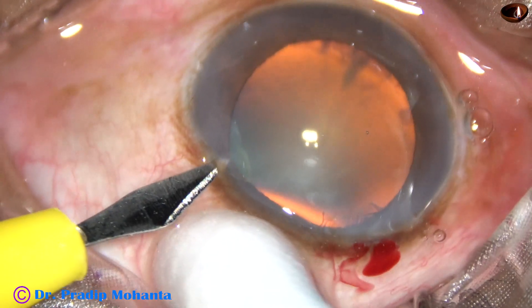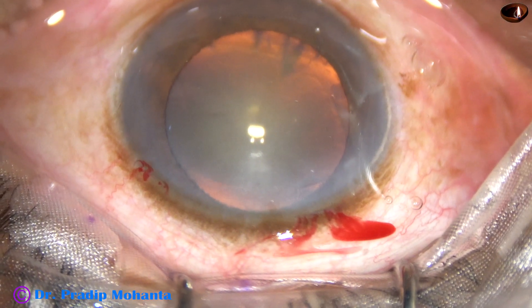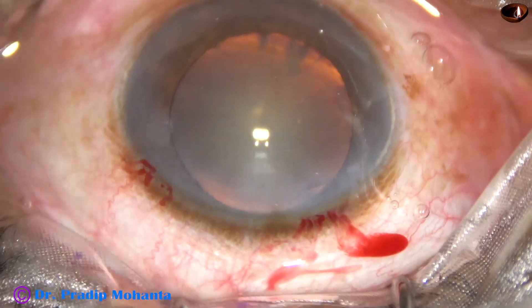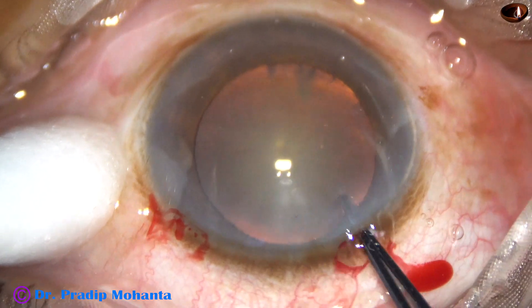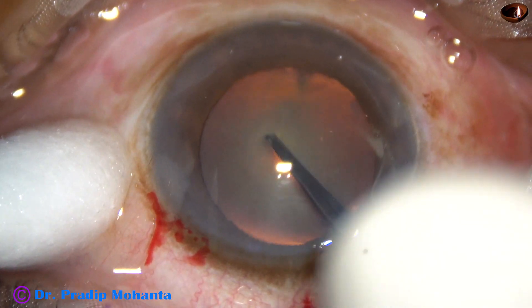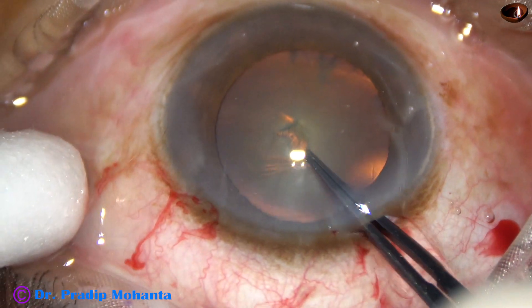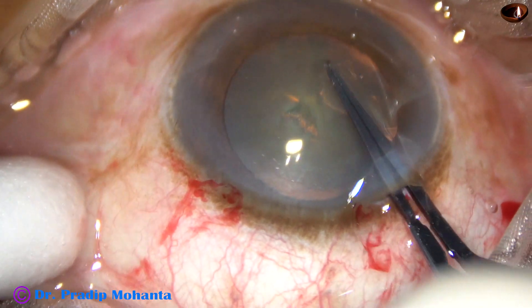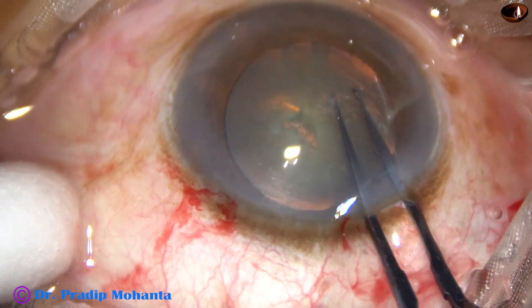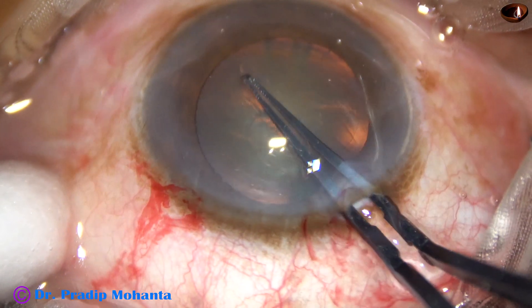Yes, we can. After the main incision and two side ports, viscoelastic is injected into the anterior chamber and applied over the corneal epithelium. The utrata forceps is introduced. The tip of the utrata forceps pierces the anterior capsule and a capsular tag is raised. The capsular tag is held with utrata forceps and the rhexis is completed with anti-clockwise movements.